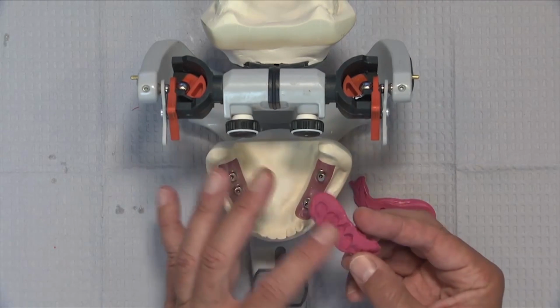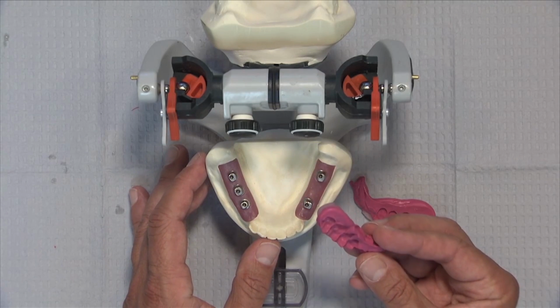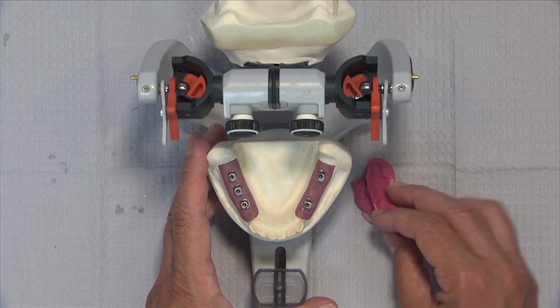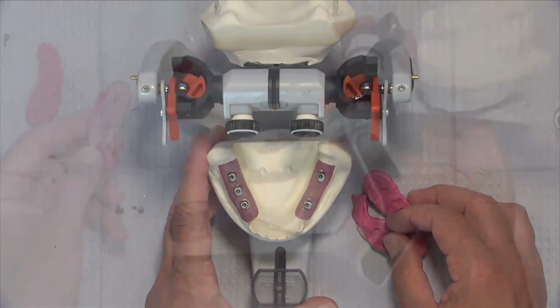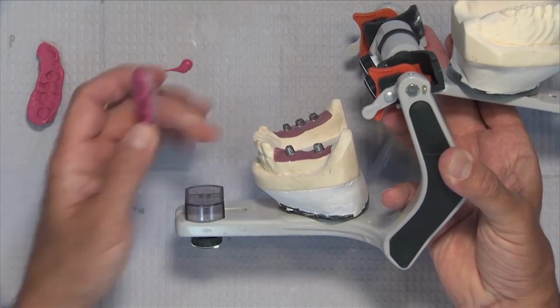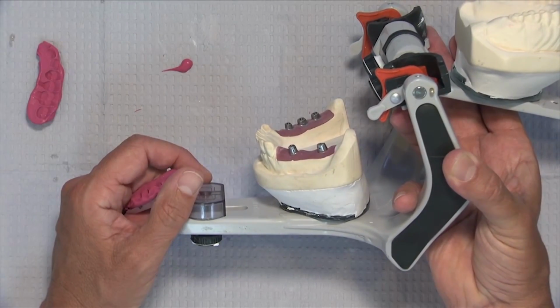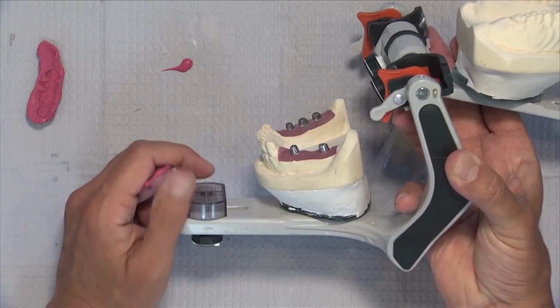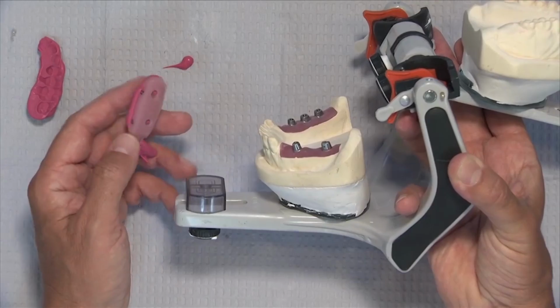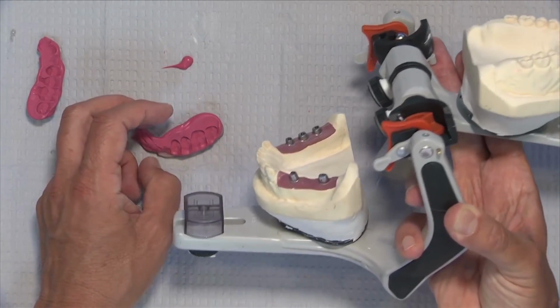You'll have a small occlusal adjustment probably to make on that biotemps bridge, just the same way that we had to grind some of the anatomy off the bite index before we did the bite registration. But that's another way to be able to provisionalize this patient with something fixed like a biotemp through the use of these duplicate abutments. So again, with the use of this positioning bite index in conjunction with some custom abutments, we're able to really solve one of the big problems that we see here in the laboratory, and that is to be able to accurately dial in the occlusion on a Kennedy Class 1 or a Kennedy Class 2 clinical situation where we've lost all the posterior teeth on either one or both sides.